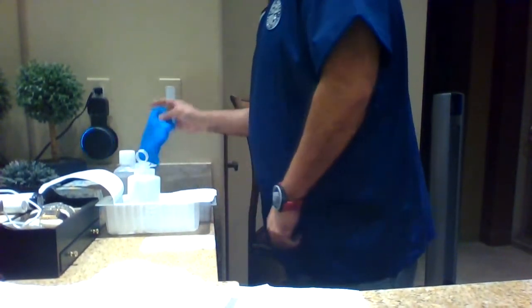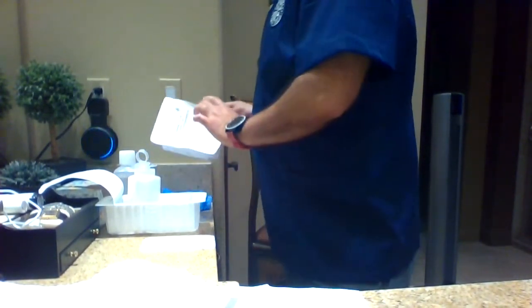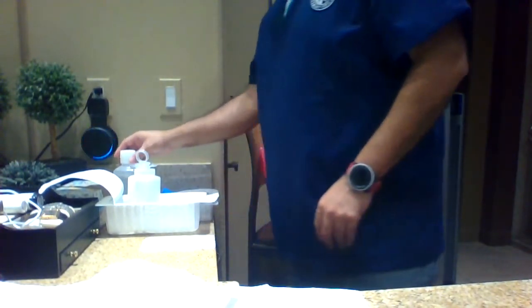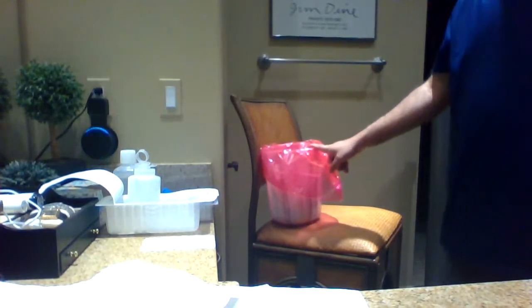Just to show you before we actually begin, I gathered all the supplies here because I don't have a lot of room. So when you see me reach over here, just like I pointed out, here's actually the wound. I have my irrigation over here, my measuring tools over here, my sterile gloves. When you see me pull this out, here's my dressing tray, my sterile dressing tray, fluid, and biohazard bag. So I'm going to attempt to fit it here. So we'll go from there.